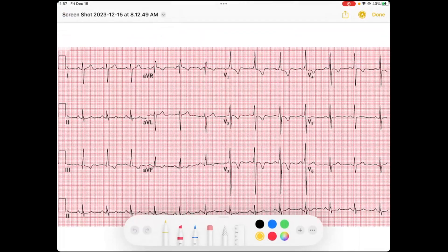All right, everybody. Welcome to our ECG of the week. We'll start off by doing what we always do — get a general sense of things. We're going to look at the forest, or the trees, which are these QRSs, and we'll look at lead two in the rhythm strip when we see a narrow, regular rhythm.